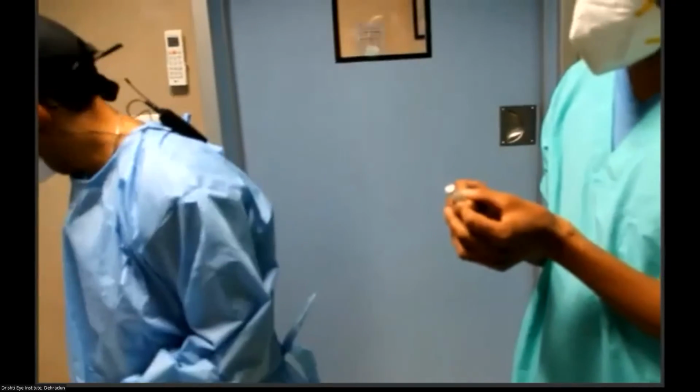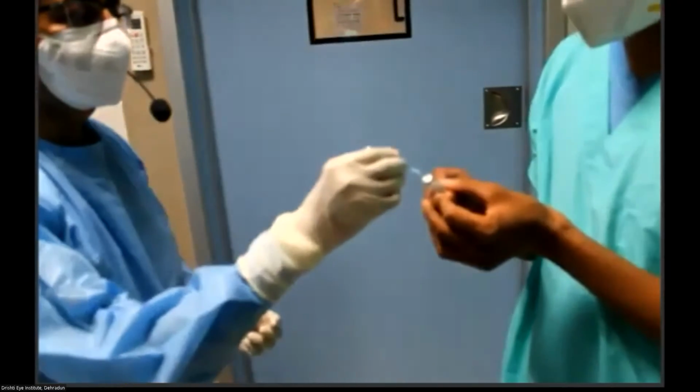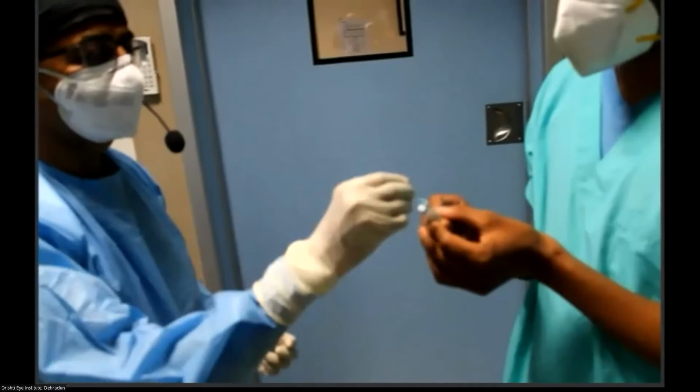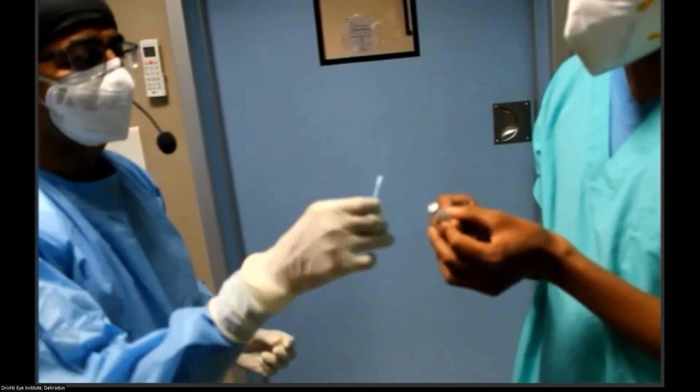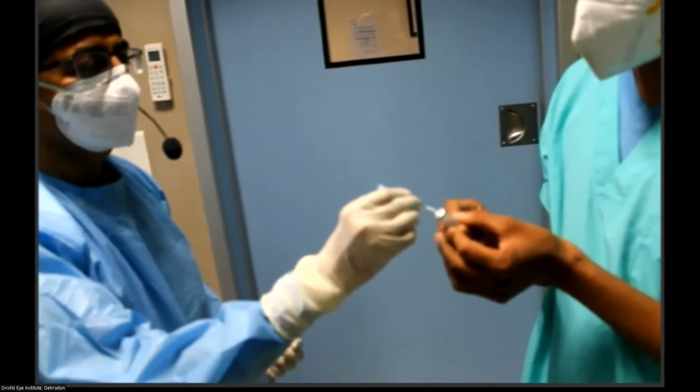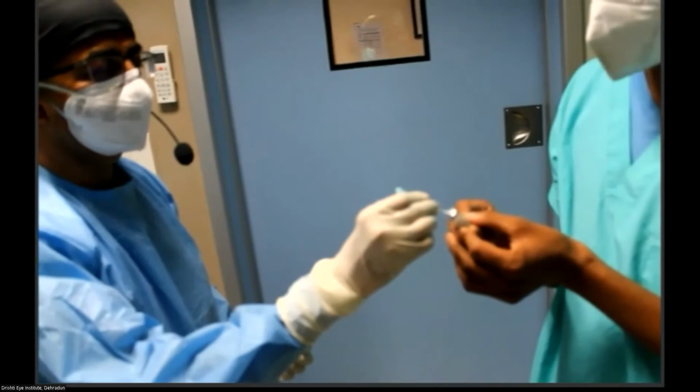So once and the second time around. So these are sterile swab sticks, and then we dry it off to take off the excess alcohol from there.